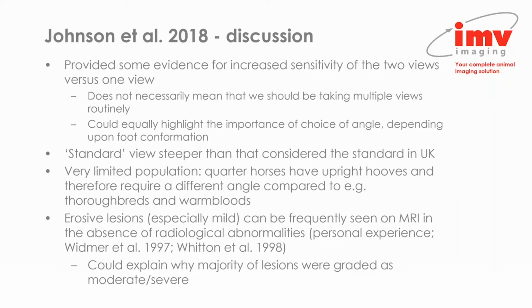And again, erosive lesions, especially mild ones, can be seen quite frequently on MRI in the absence of any radiological abnormalities. In addition to this being my personal experience, it has also been mentioned in 2 studies, which I will reference at the end.